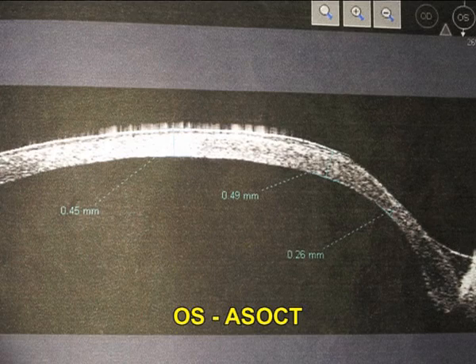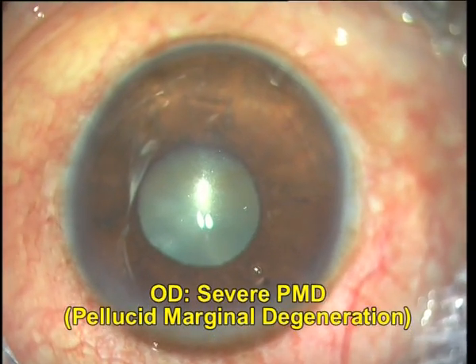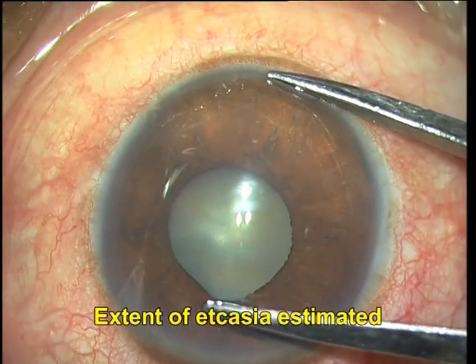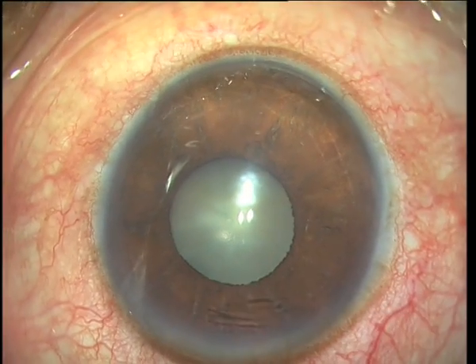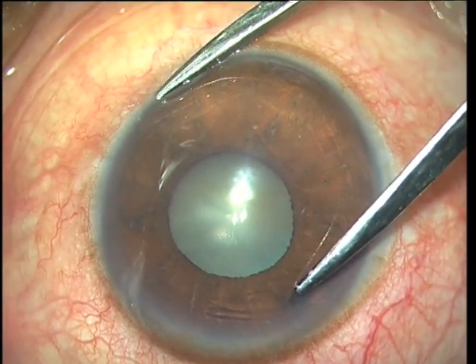The left eye AST pachymetry is also similar with inferior thinning, and I have taken up the right eye for surgery first. You can see the severe grade of pellucid marginal degeneration. What I'm doing is estimating the extent of ectasia first, both in the horizontal oblique and the vertical meridia.